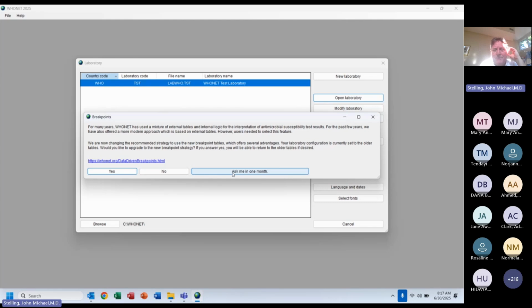Or ask me in 1 month, because if you're not in charge, you want to learn more about it, you might not be ready to say yes or no. And you can say, just ask me next month. And you can go back and forth. You can say yes, and you can say, I want to go back. So WHONET is now going to ask you, do you want to switch to the new way? Yes, I do.